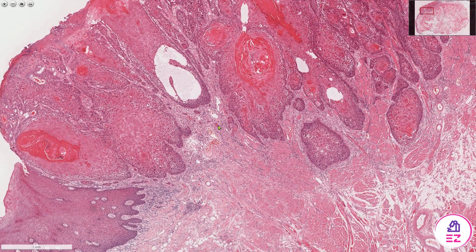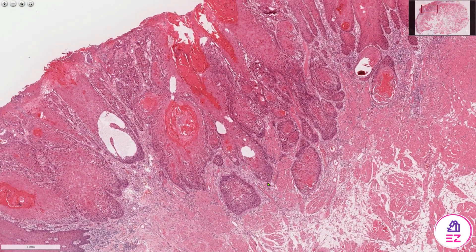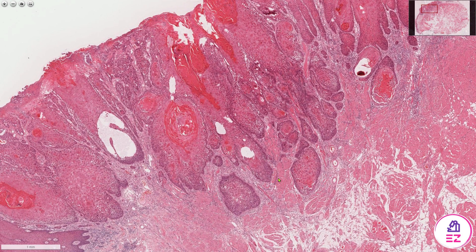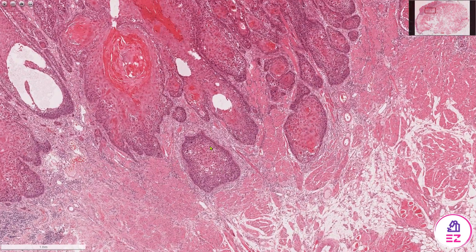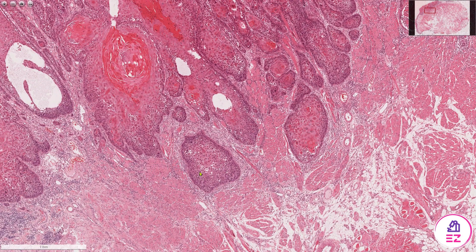Finally, another thing we would comment on is the differentiation of the tumour. This tumour is forming keratin so you may think it's well differentiated, but at the deeper aspect the keratin is less obvious. So I'd probably call this moderately differentiated — it's not poorly differentiated because we can still see it's epithelial in nature and there are areas of dyskeratosis.